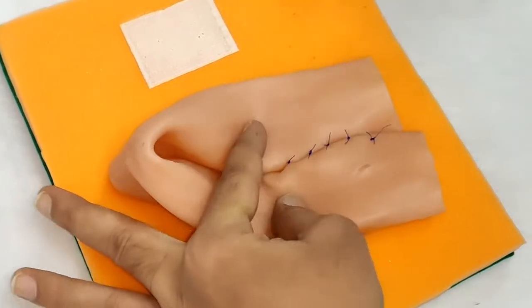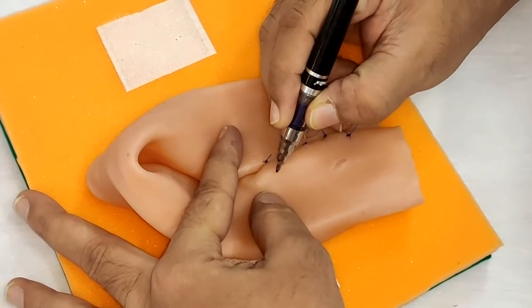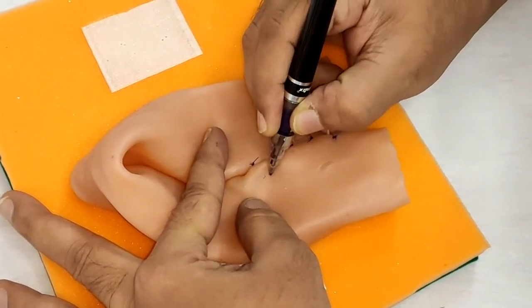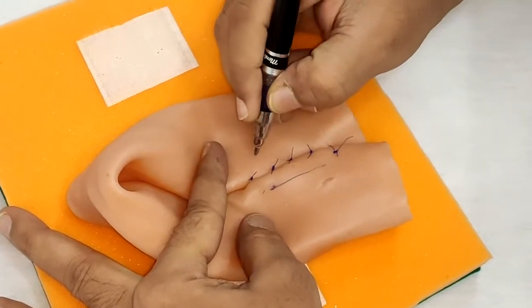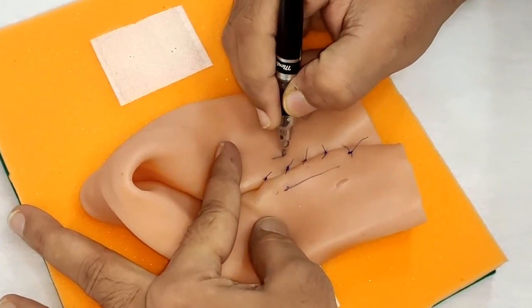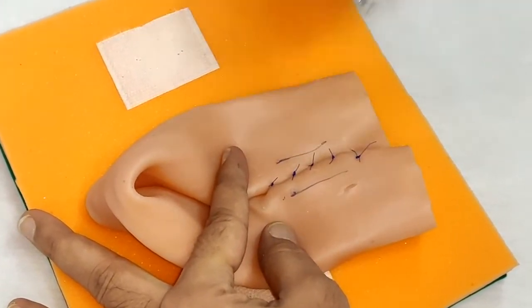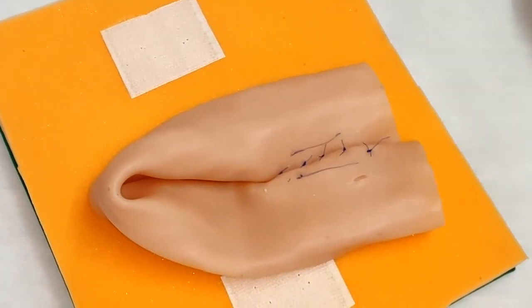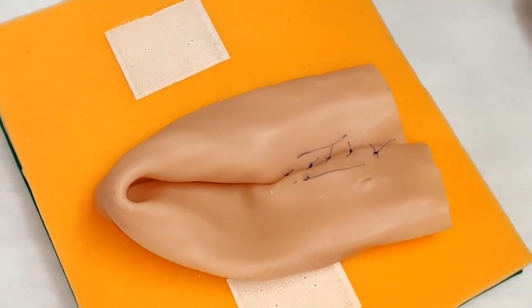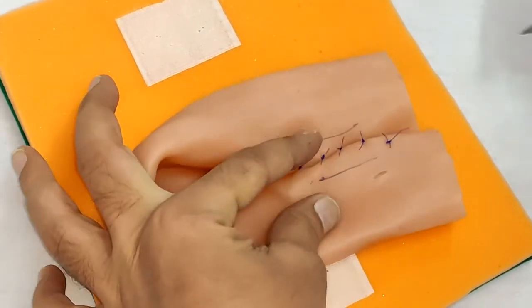Once we have approximated the two loops, what we have to identify are the two sides of the incision that we have to take. They need to be parallel to the two loops. We will use a blade to make a small cut, but you can do the same if you have an electrocautery.